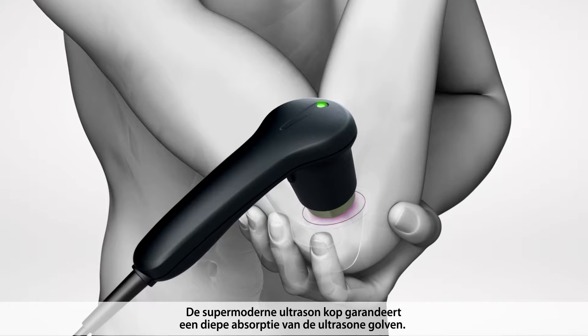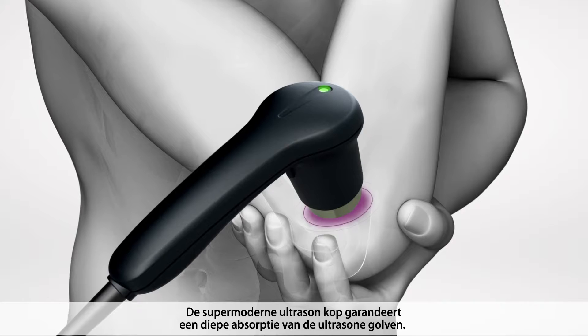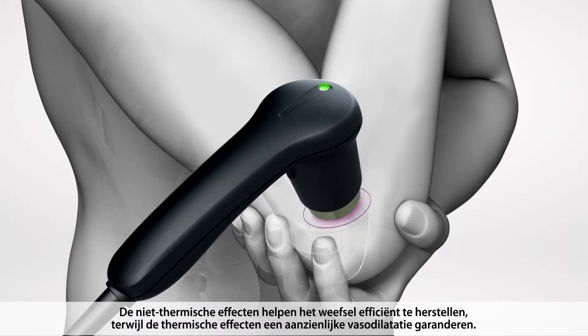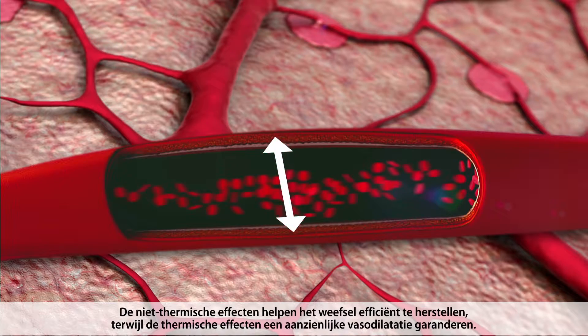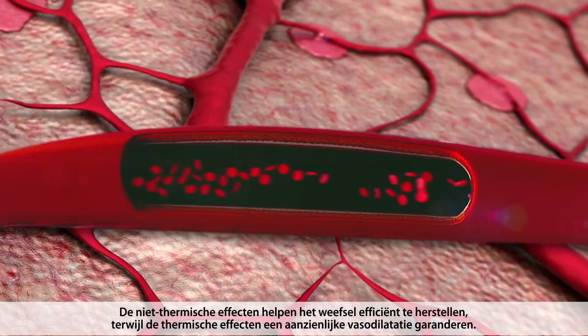The state-of-the-art ultrasound head ensures a deep absorption of the ultrasound waves. The non-thermic effects contribute to efficient tissue repair, while the thermic effects guarantee significant vasodilatation.